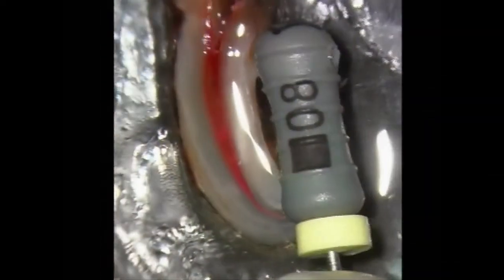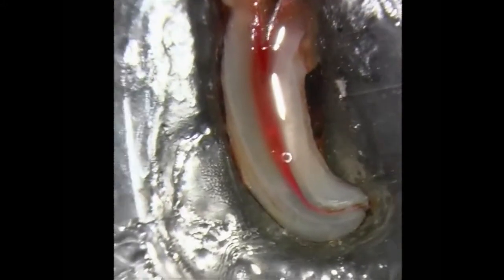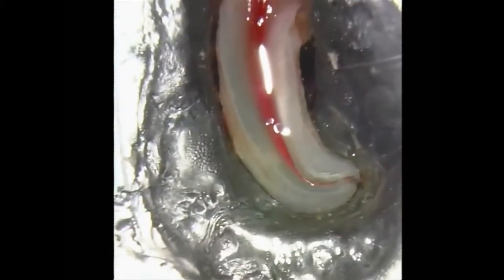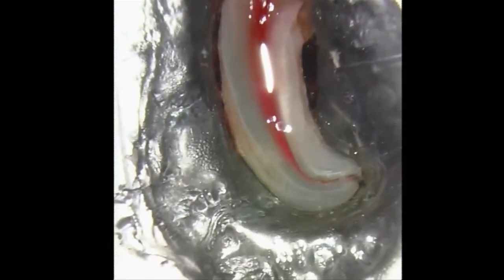One of the initial tasks that we must do when starting any root canal procedure is the establishment of an initial pathway or glide path in the root canal. Ideally, and especially in small curved canals, the use of a small K file, such as a number 8 file that has been slightly curved in the apical 1-3 mm, as depicted in this video, should be used to determine the initial canal patency.